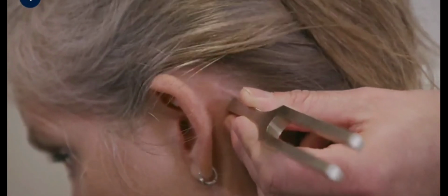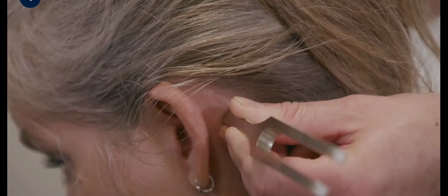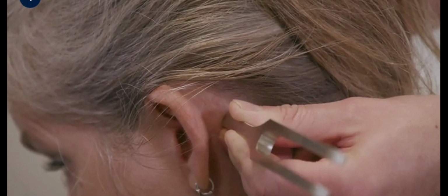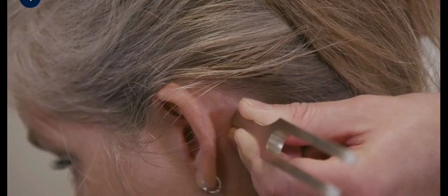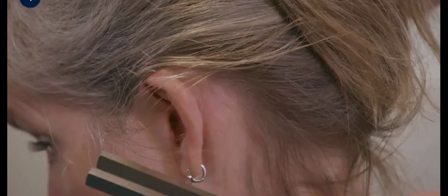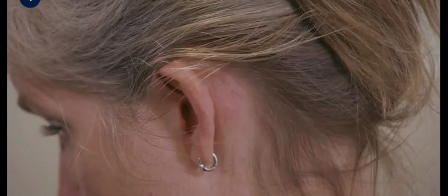Rinne's test is performed by placing the vibrating tuning fork over the mastoid process to test bone conduction. The examiner confirms that the patient can hear the sound of the tuning fork and then asks them to indicate when the sound has disappeared. When the patient can no longer hear the sound, the examiner moves the tuning fork in front of the external auditory canal to test air conduction. If the patient can hear the sound again, this suggests that the air conduction is better than bone conduction, which is normal. Rinne's test is then repeated on the other ear.